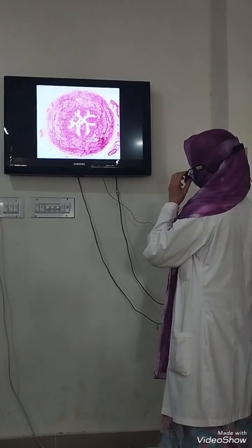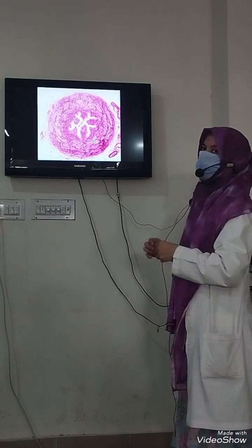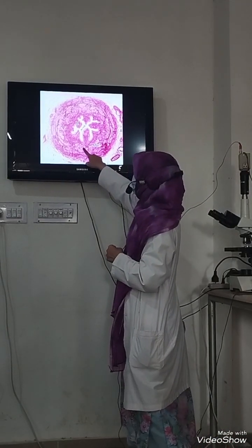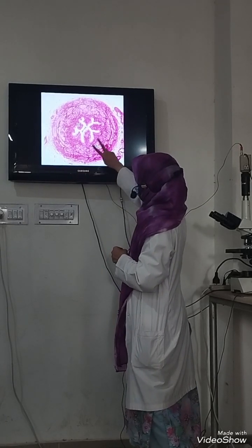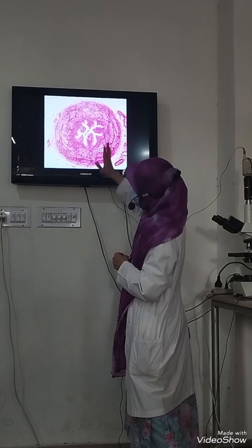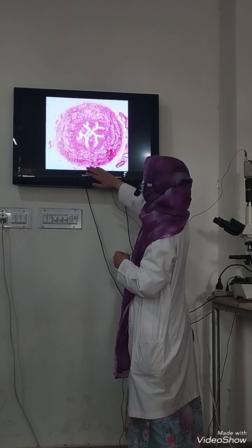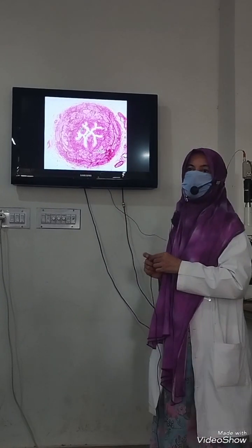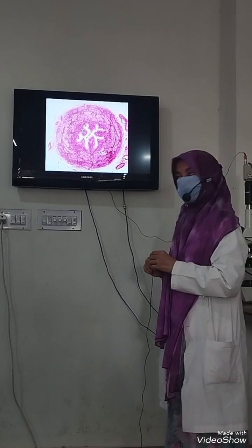And when this ureter has to reach towards the urinary bladder, a third layer is sometimes added, that is the outer longitudinal. So in routine we get the inner longitudinal and the middle circular, then near the urinary bladder we get an additional layer, that is the outer longitudinal. Otherwise, two layers are there, right?